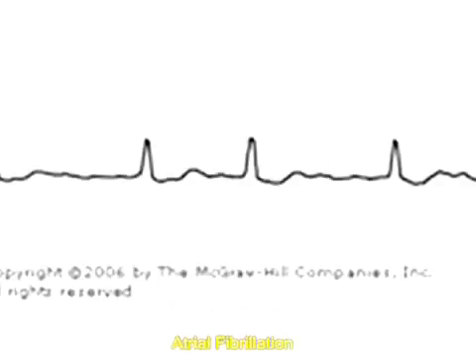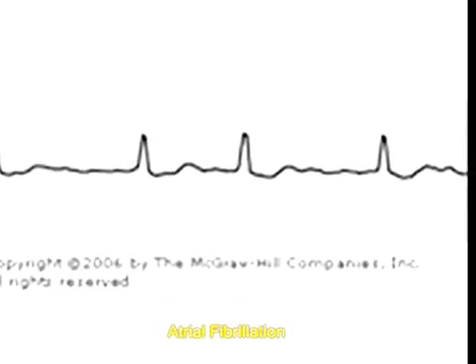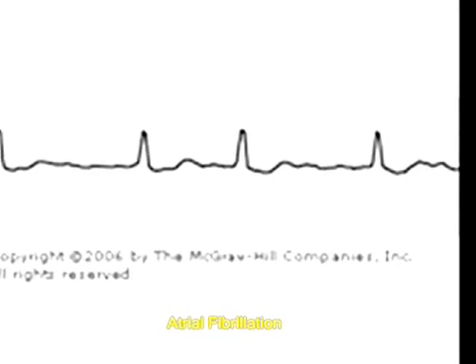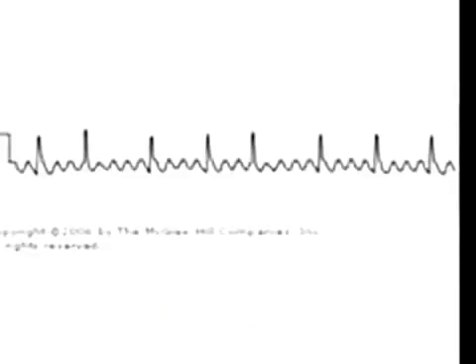Now you can see atrial fibrillation. In atrial fibrillation there is an irregularly irregular rhythm — the atria are contracting very irregularly, and that needs to be treated with medications like diltiazem. Similarly, you can see atrial flutter, which is characteristically saw-tooth shaped, with an atrial rate varying between 250 and 350. Whenever you see that saw-tooth pattern you should think of atrial flutter.